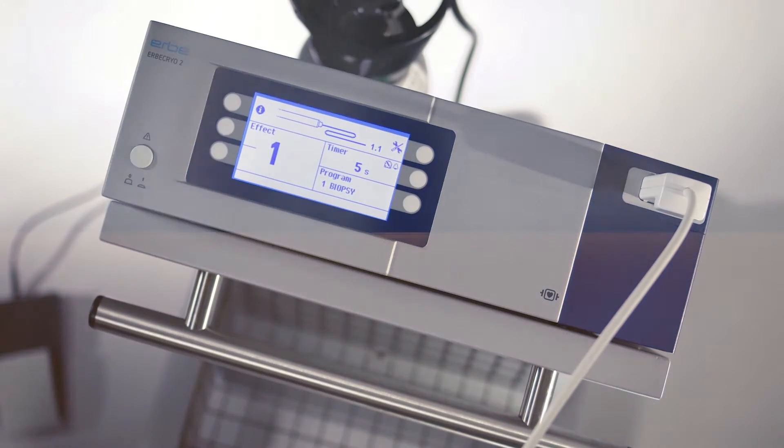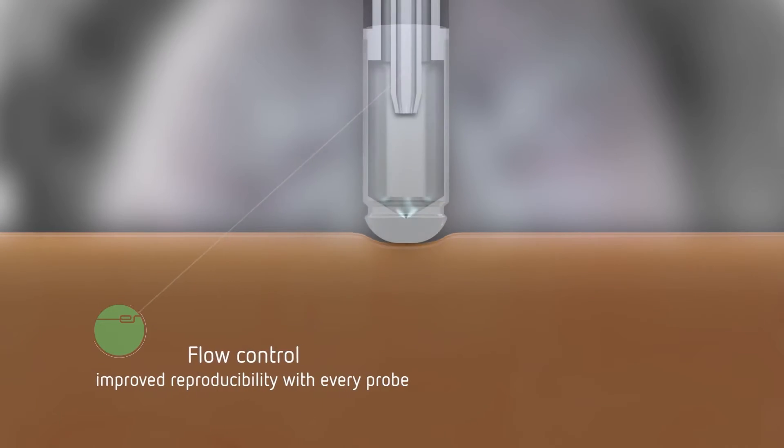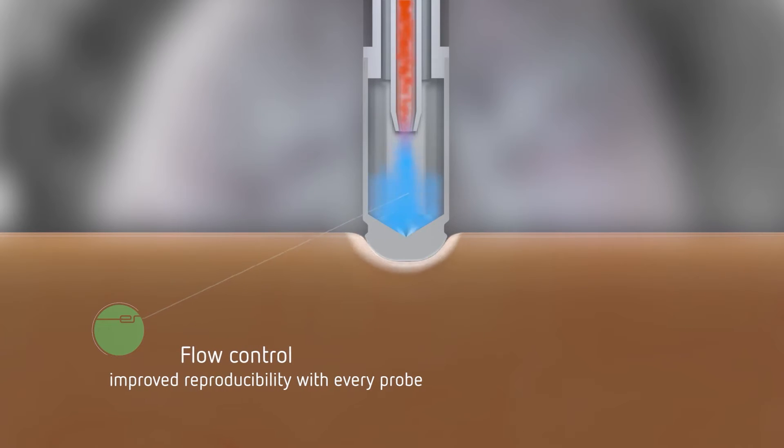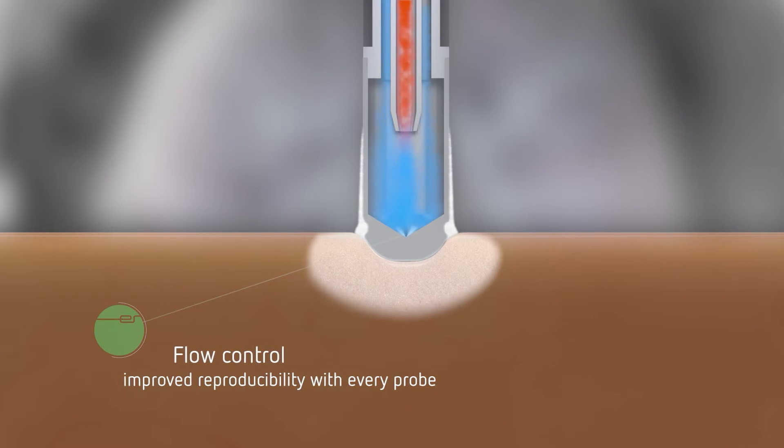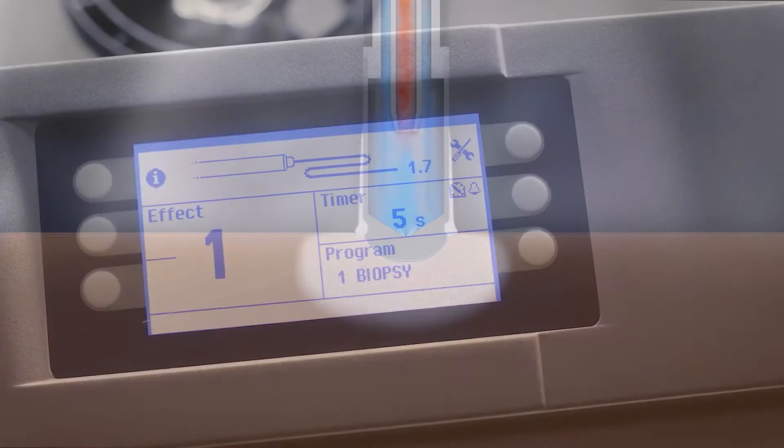During activation, the flow control of the Herba Cryo 2 provides just as much gas as needed for the maximum freezing power of every probe size.